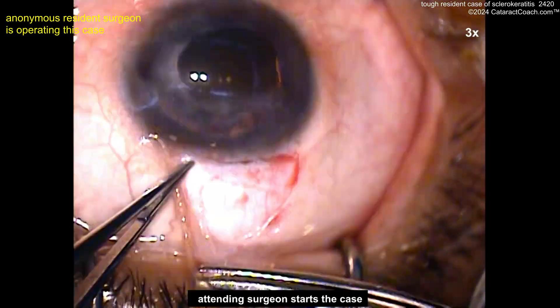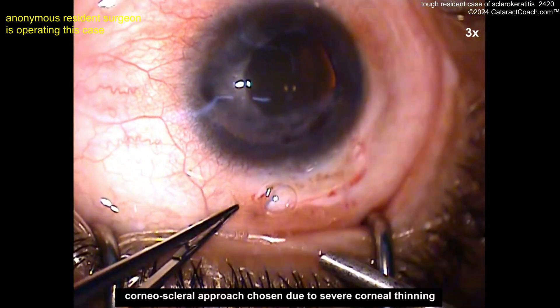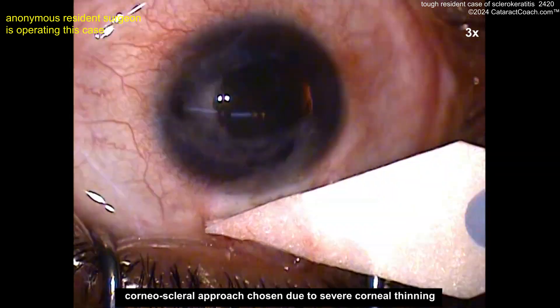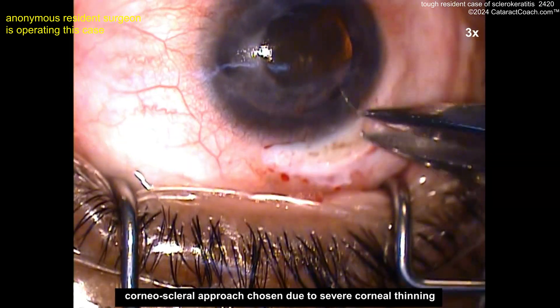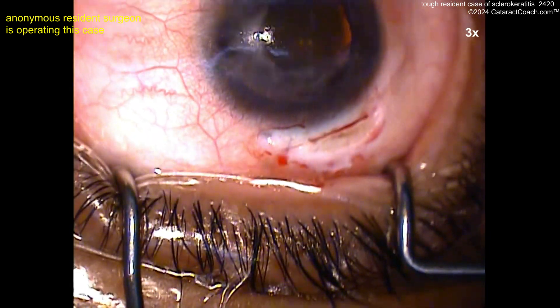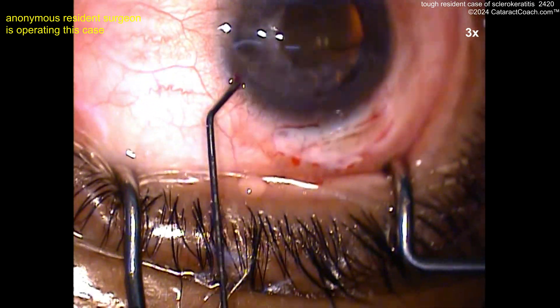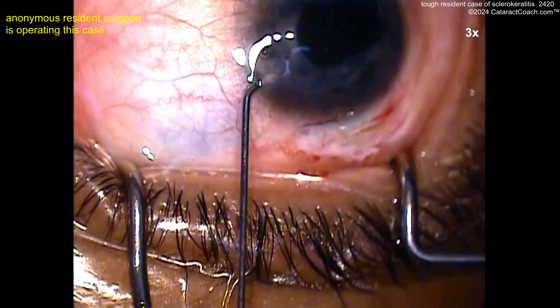Now we've got an attending surgeon starting the case here — going to do a scleral tunnel. I like the idea of a scleral tunnel: if you've got anything weird going on with a cornea, avoiding a corneal incision is probably a good idea. Now marking off here — that's not too bad, that looks good. Half scleral depth groove there. Here's the paracentesis, and a lot of heme going on here.